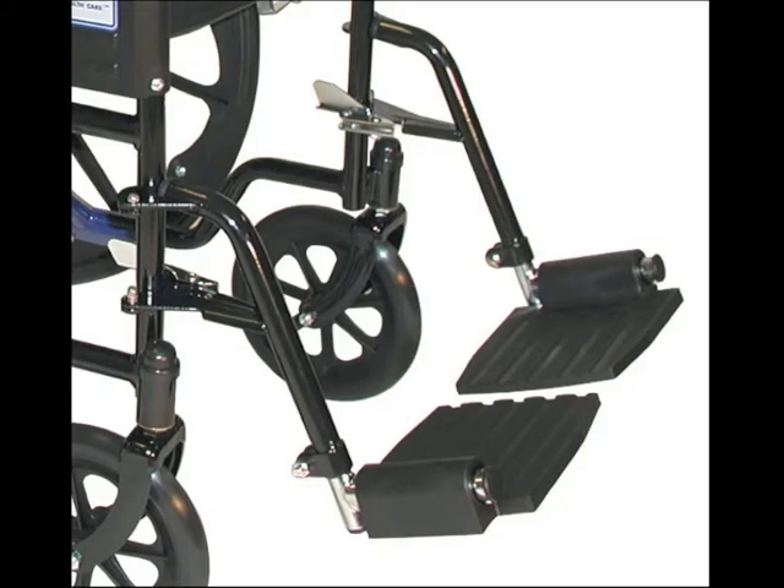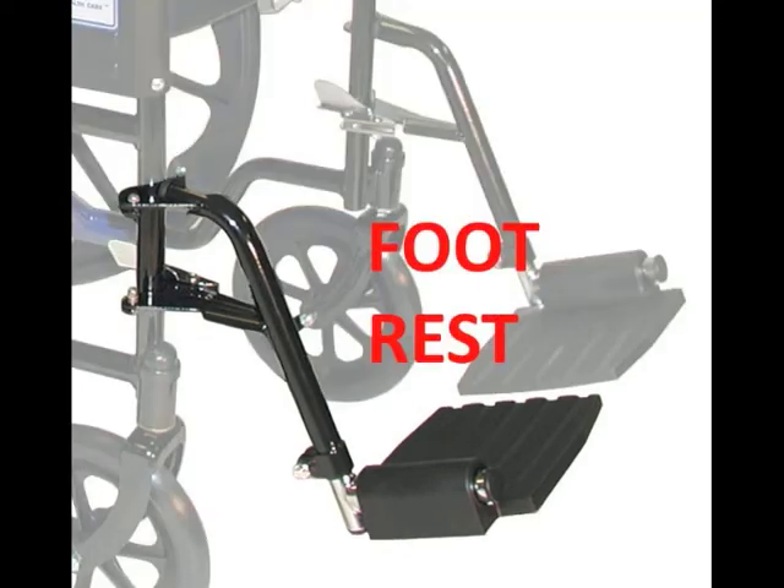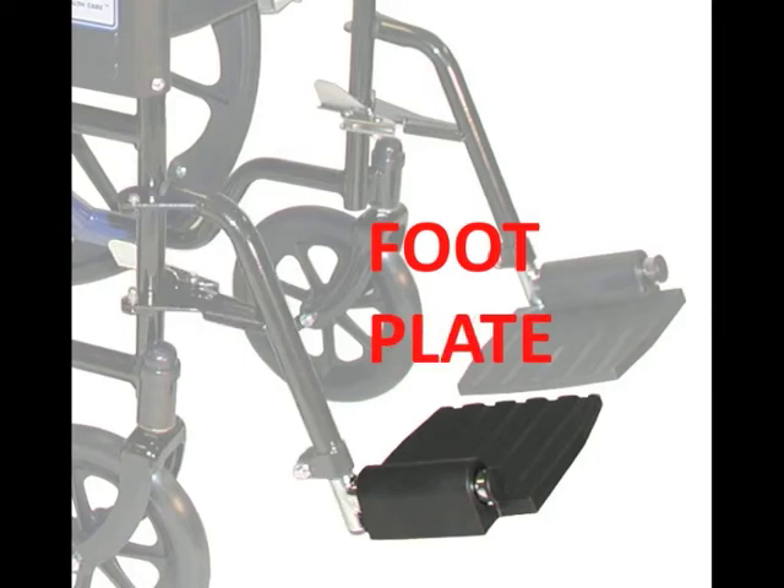The footrests support your feet so they don't drag on the floor or get caught up under the wheelchair. If you use your hands to push the wheelchair, your feet will be on the footrest most of the time. The footrest is the entire part that hangs in front of the wheelchair. The flat part on which you place your foot is called the footplate.